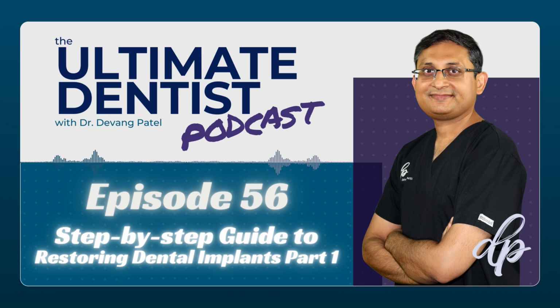And you say, well, the implant's not placed in the right position. But ultimately it'll be your responsibility, if you have taken this case on, to provide an aesthetic restoration. Of course, it's a joint responsibility, but in the patient's mind, they will think it's your responsibility. So that's the number one factor: patient expectation and communication with the implant surgeon.